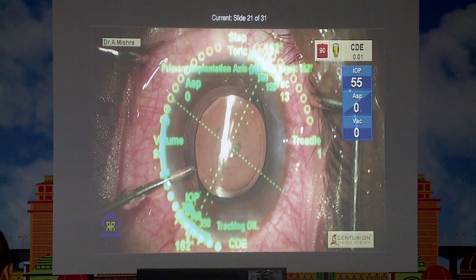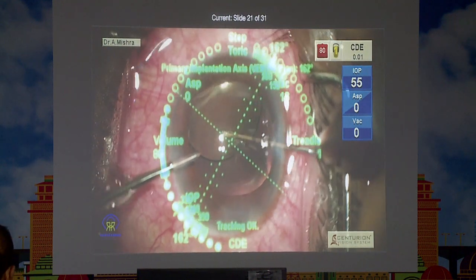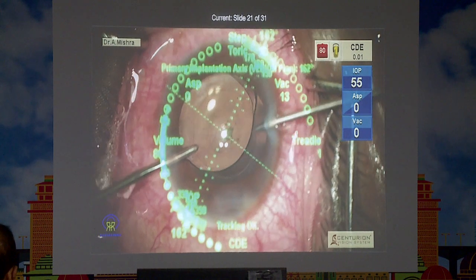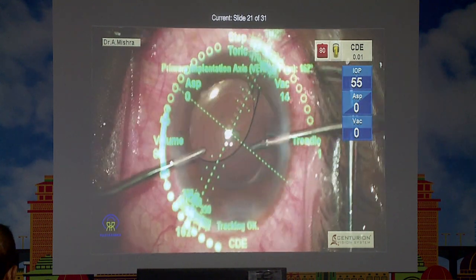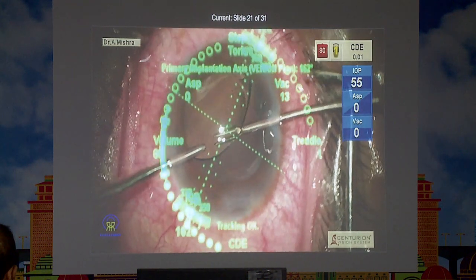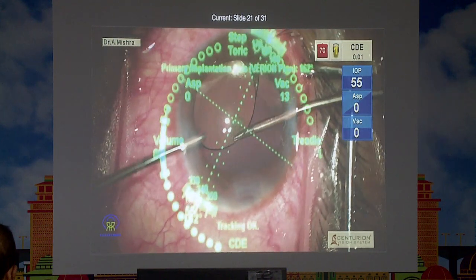This is another case wherein there was a posterior polar cataract, and it was a young patient. After implanting the IOL under cover of BSS again, I decide to remove the central PC plaque, which is occupying the center of the visual axis. With the help of microrhexis forceps, I go ahead under the IOL, place a nick first.